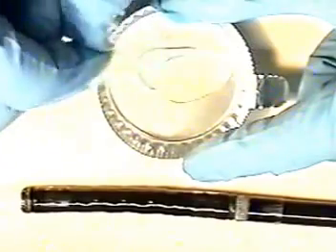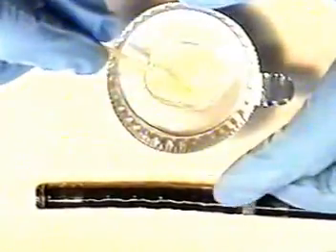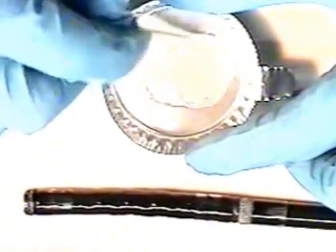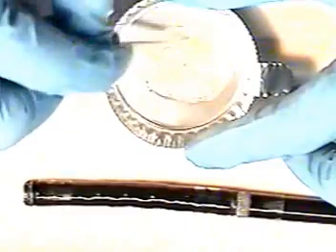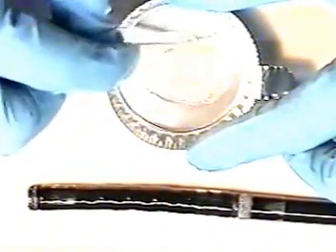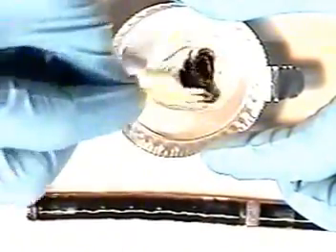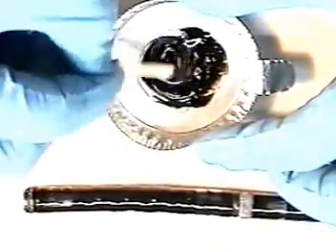We will carefully mix epoxy according to manufacturer specifications. Some epoxies can take up to 1 to 2 hours in order to start to set. Once you're used to applying bending rubbers, you may start mixing your glue before starting repair of the bending rubber. I will now add a small amount of black pigment to our epoxy. It is advisable to use a class 6 type epoxy.